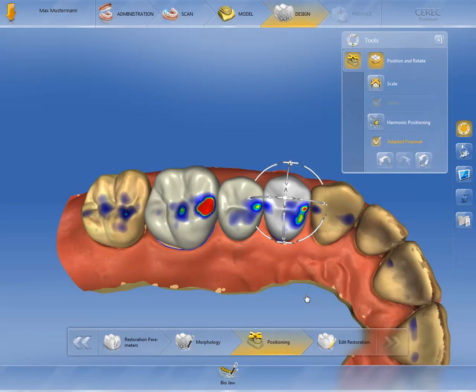Once you have completed positioning the restoration, you can allow calculation of the restoration. At present, only the preparation margin would be taken into account here. The proposal is calculated by clicking on Edit Restoration. For details on how to process this further, see the second part of the design phase.